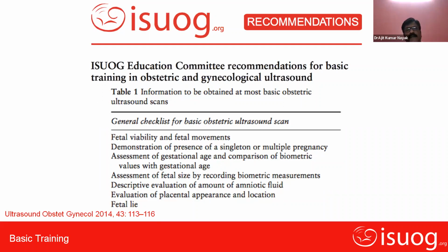And this is the checklist for basic obstetric ultrasound. As I already told, we should know the fetal viability by looking for the fetal heart and fetal movements. And we should know the number of fetuses, whether it is a singleton or multiple pregnancy. And of course, we have to assess the gestational age, and compare the biometric values with gestational age, and accordingly we can estimate the fetal weight, and we can diagnose whether there is macrosomia or fetal growth restriction.